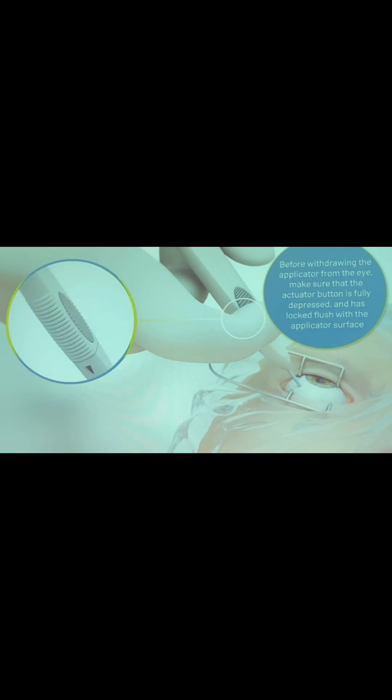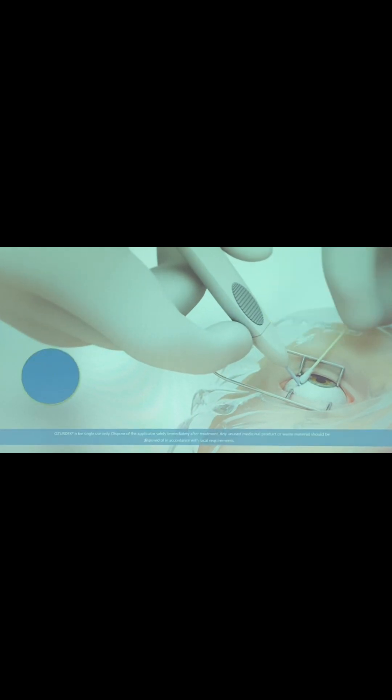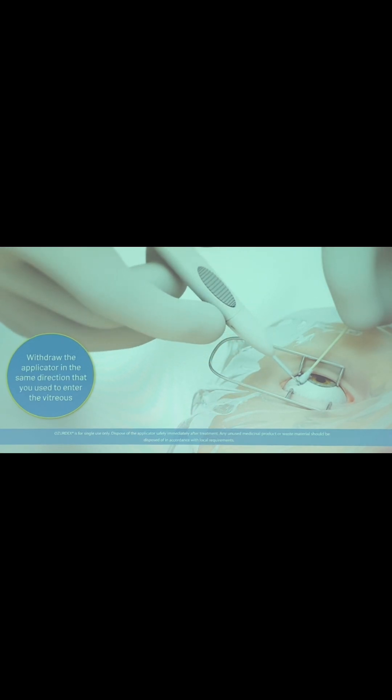Depress the actuator button slowly until you hear a click. Before withdrawing the applicator from the eye, make sure that the actuator button is fully depressed and has locked flush with the applicator surface. Withdraw the applicator in the same direction that you used to enter the vitreous.